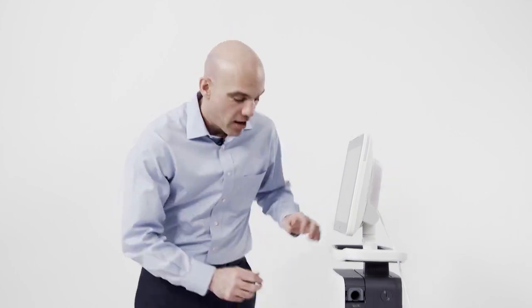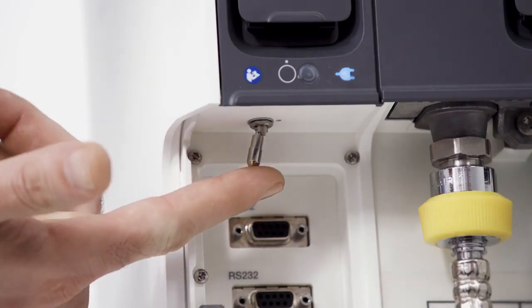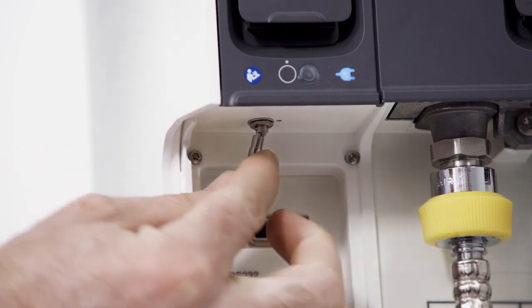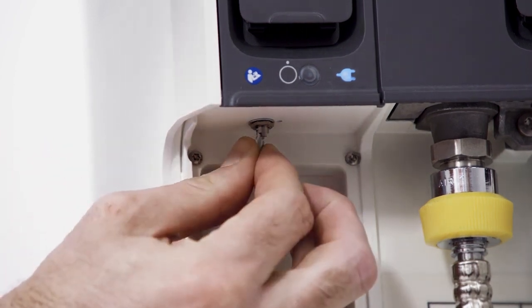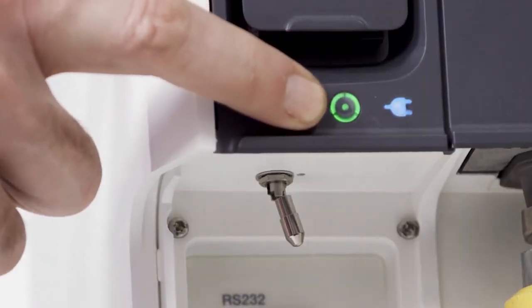To get started, plug in the power cord, then connect to your air and oxygen sources. From there, locate the hatch, open it, and locate the power switch. To turn the device on, pull the toggle down and push it over. Note the green power light is now illuminated.